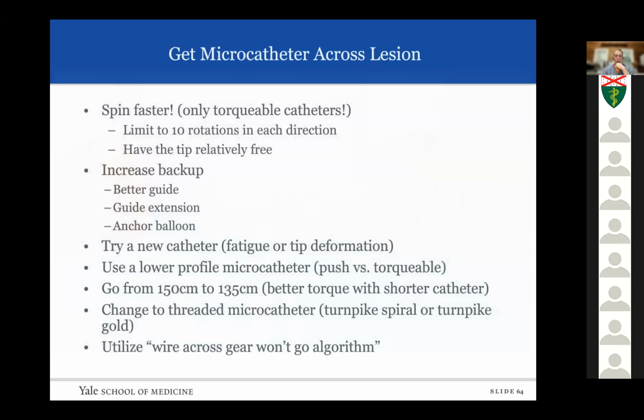So we talked a little bit about spin faster. The other thing that you can do is increase the backup. So we talked about guide support. We talked about guide extension. We talked about anchor balloons. And this is just really starting to bring all of these discussions from earlier together.